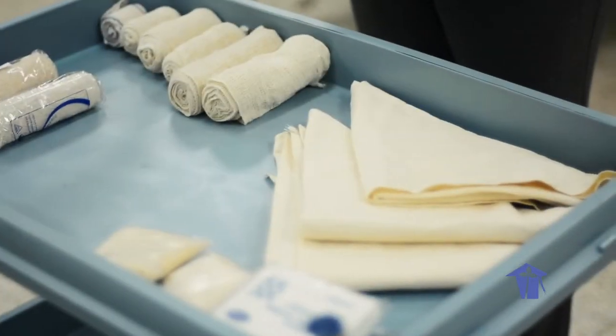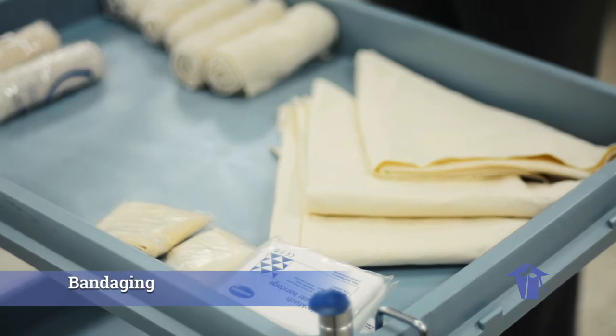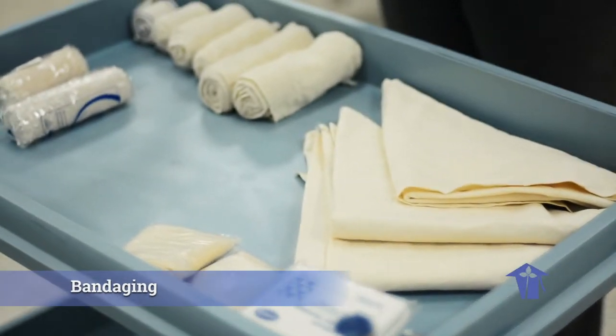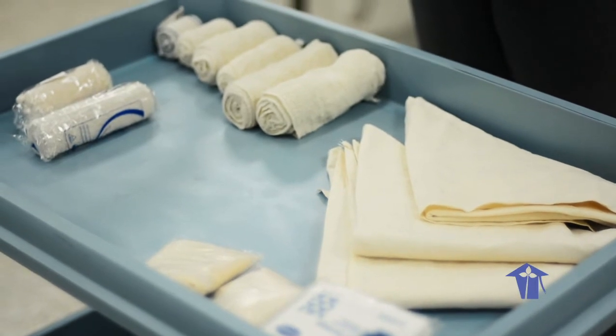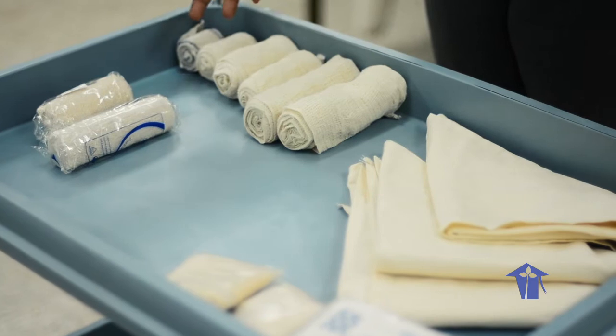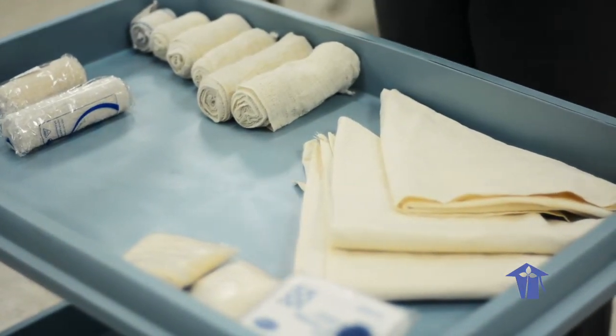Good morning. Welcome to our simulation lab at El Dorado, where we are going to be conducting another nursing skill — a rather simple skill in fact, called bandaging. We are going to show you several types of bandaging styles today. Before we do that, we'd like to talk a little bit about the tool that we're going to use. Bandaging, as I mentioned, is a basic nursing skill.